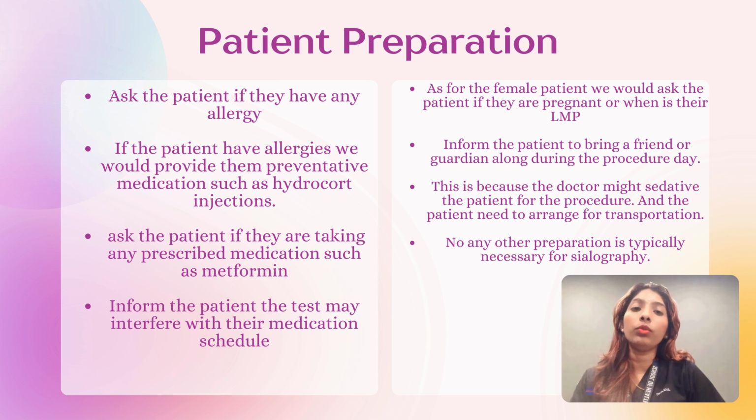We would advise the patient to bring a guardian or a friend during the procedure. This is because during the procedure, the patient will be given a sedative injection just to calm them, and after the procedure, the patient may still have some dizziness and be unable to drive themselves from one location to another. Other than that, no other typical preparation is needed for the sialography procedure.